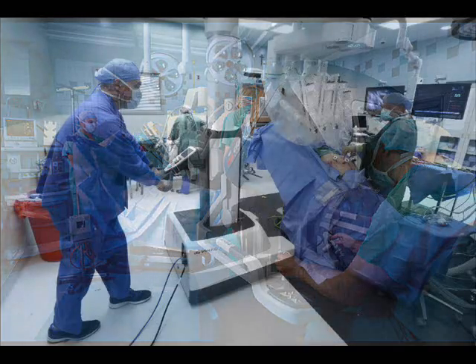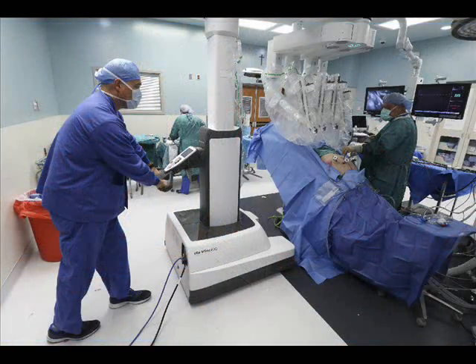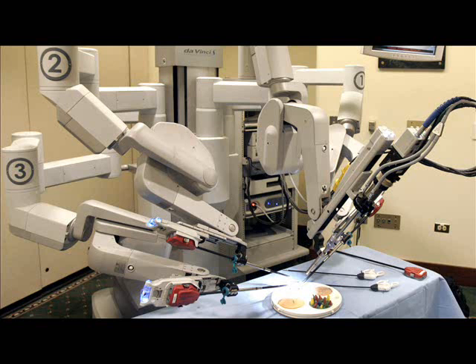General surgery. In early 2000, the field of general surgical interventions with the Da Vinci device was explored by surgeons at Ohio State University. Reports were published in esophageal and pancreatic surgery for the first time in the world, and further data were subsequently published by Horgan and his group at the University of Illinois and then later at the same institution by others, in 2007.